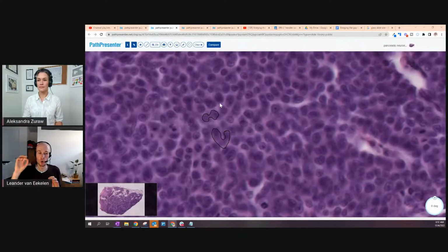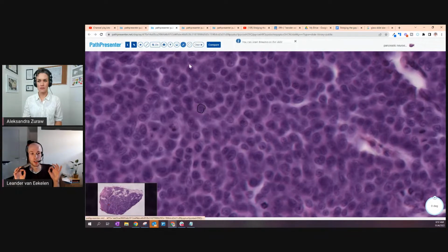So instance segmentation. It's very straightforward. Instead of doing cell type A, cell type B, and then regardless of objects, you treat everything as stuff, now everything becomes things. So everything is a discrete object. That means your model, instead of only outputting the segmentation, the actual shape of the object, also starts giving as output, for example, number 1 for object 1 of cell type A, or cell type C object number 5. So every object belonging to that class gets a number. So this is object 10,000, and they're all discrete objects.